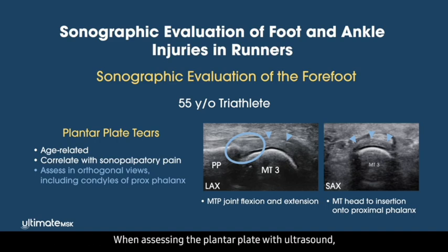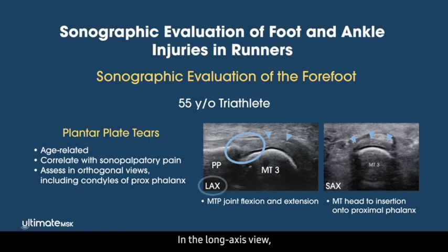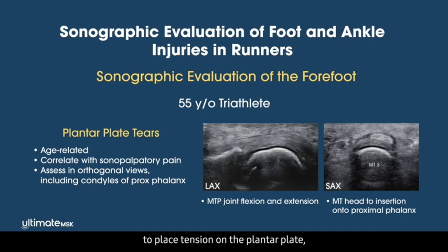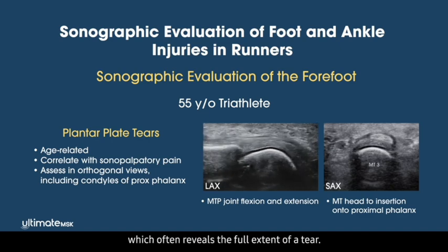When assessing the plantar plate with ultrasound, it should be evaluated in both long and short axis views. In the long axis view, I gently flex and extend the toe to place tension on the plantar plate, which often reveals the full extent of a tear.